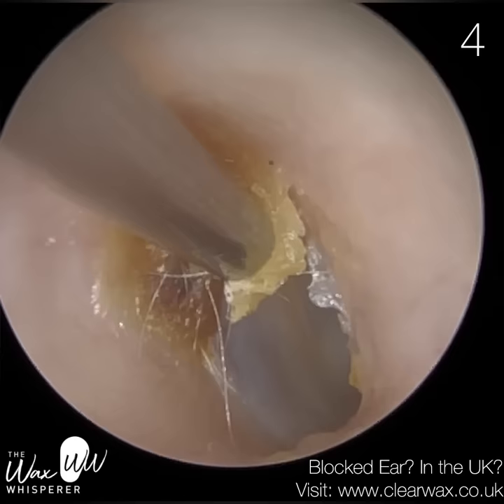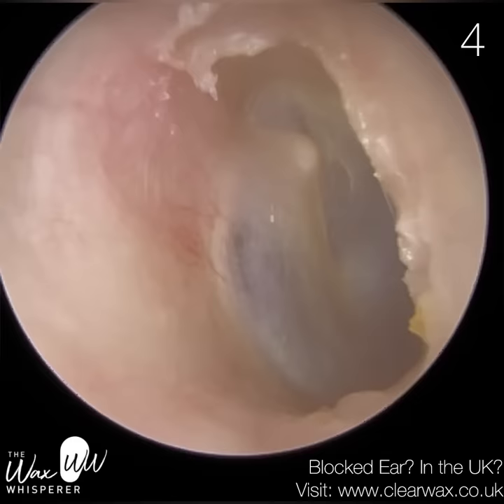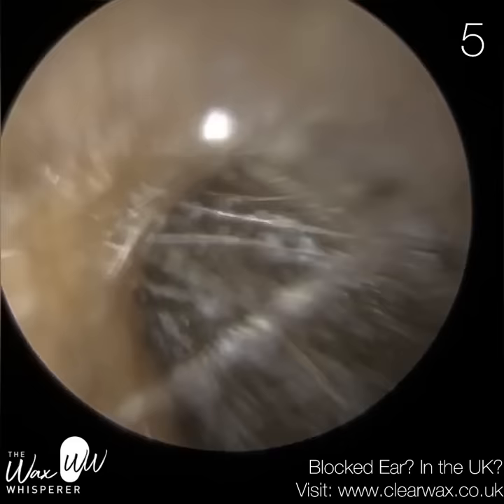There are some other potential causes as well — you can get internal feedback if the microphone ports are blocked by debris. Or if someone has a profound hearing loss and there's a lot of amplification, there will inevitably be some sound leakage. Patient four was successfully treated — their hearing aid, I can confirm, had stopped whistling post-procedure.